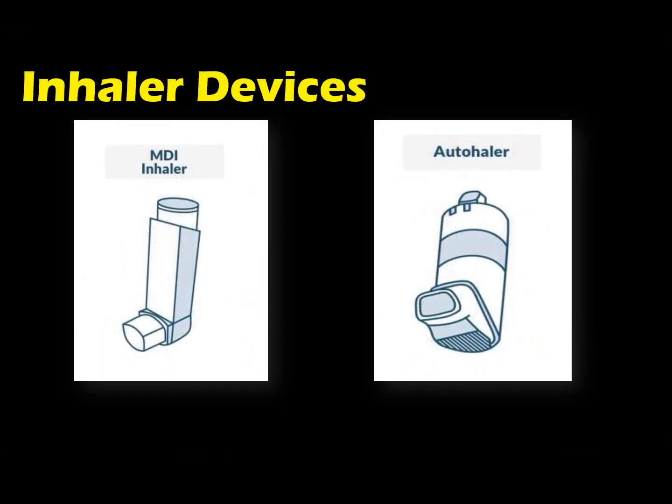So we now first go to the MDI. MDI stands for metered dose inhaler. It is a handheld aerosol device that uses a propellant to deliver the medication or therapeutic agent. It has some advantages and disadvantages. Advantages of the MDI would include portability, multi-dose delivery capability, and a lower risk for bacterial contamination.